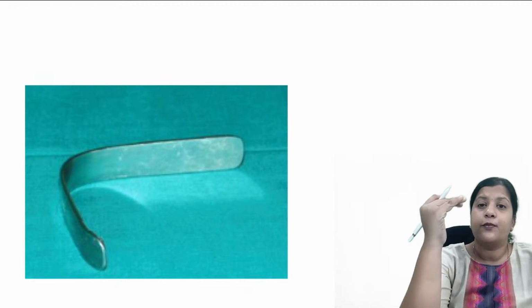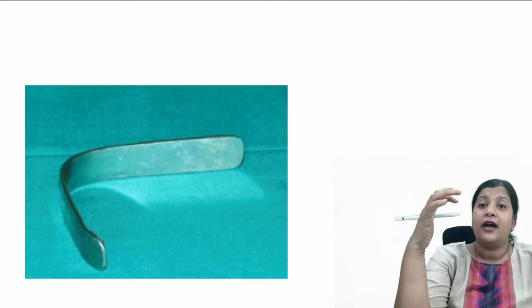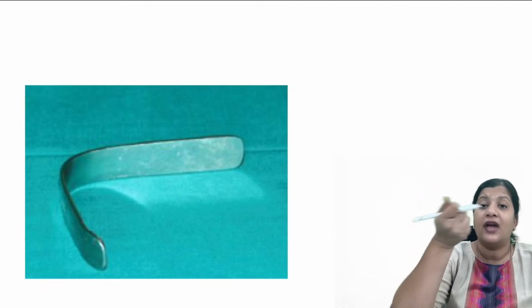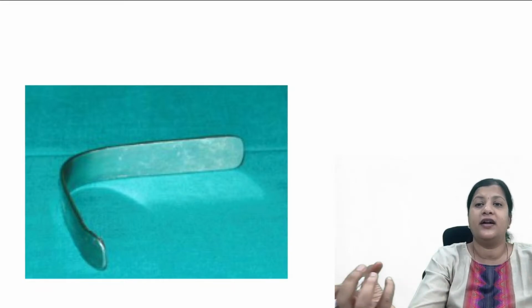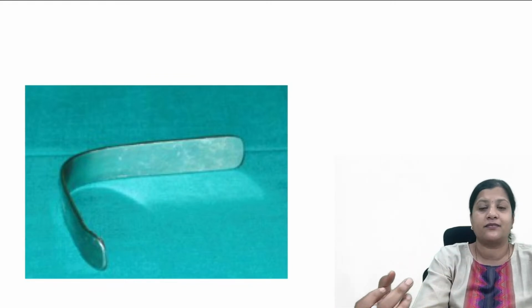Kanishkraj, you can use it in adenoid, but the problem is adenoid, we don't dissect it from the upper pole to the lower pole to get a pedicle or a tag which can be cut or crushed. In adenoid, it is like a bag of worms. So we have to just curette it off to remove that tissue. Okay, so here in adenoid, we don't use a snare.